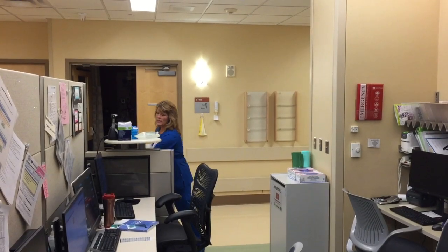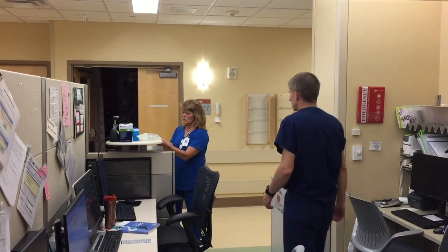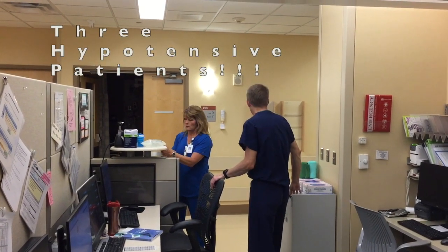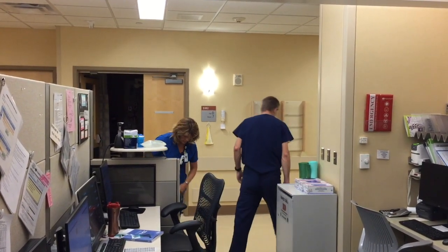Three hypotensive patients just came in to rooms six, seven, and eight. Let me get the ultrasound machine.